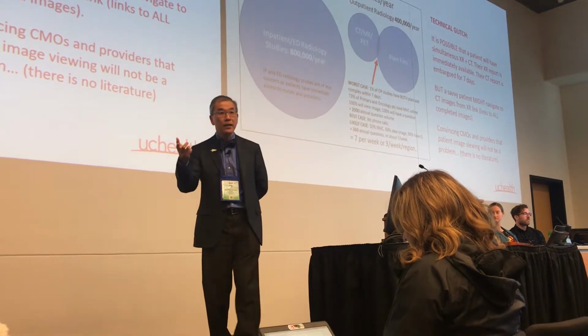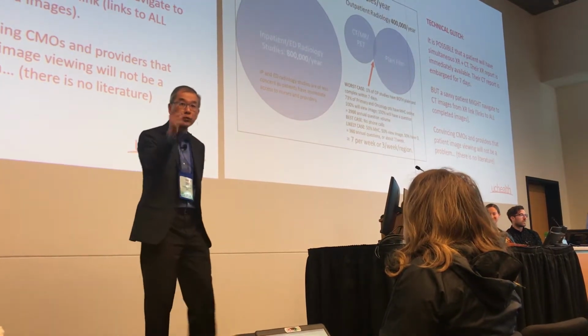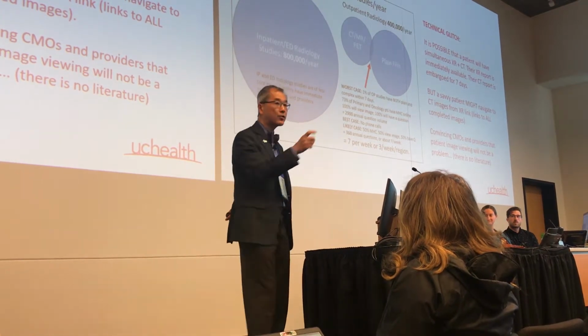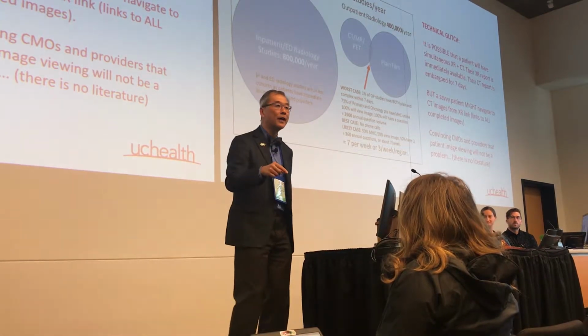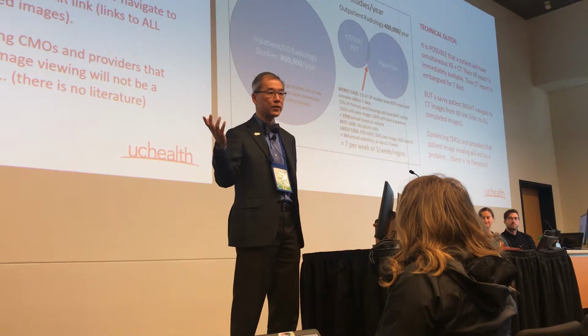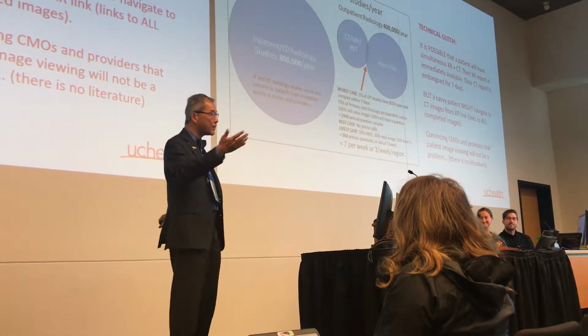So here's the gotcha, right? If someone very cleverly, and probably most of you in this audience, would click through to your plain film report, get your image. The Radiology Viewer allows you to see all images. So you, oh look, there's CAT scan images in here. And you know, what fraction of the time, and of course our leadership thinks 100% of the time, people will complain that I see my CAT scan images, where the F is my report?